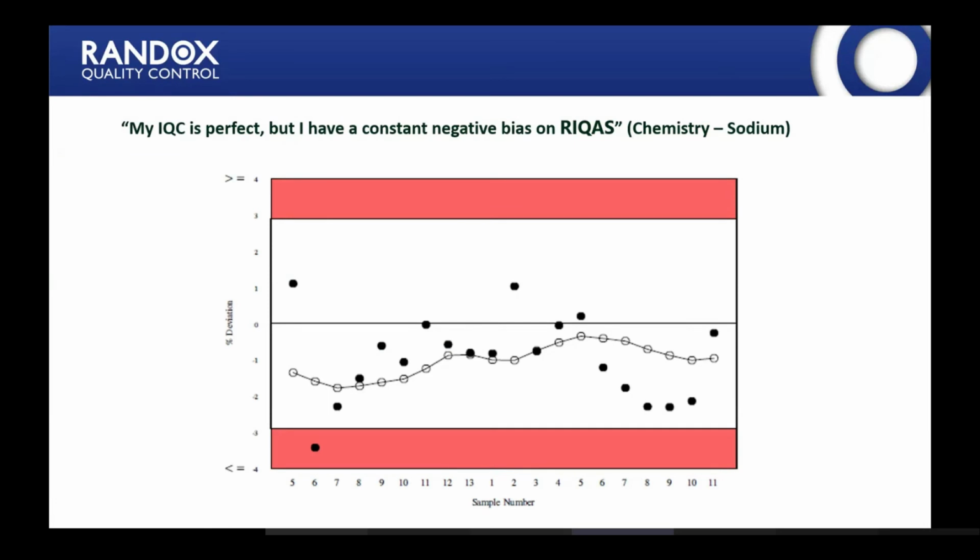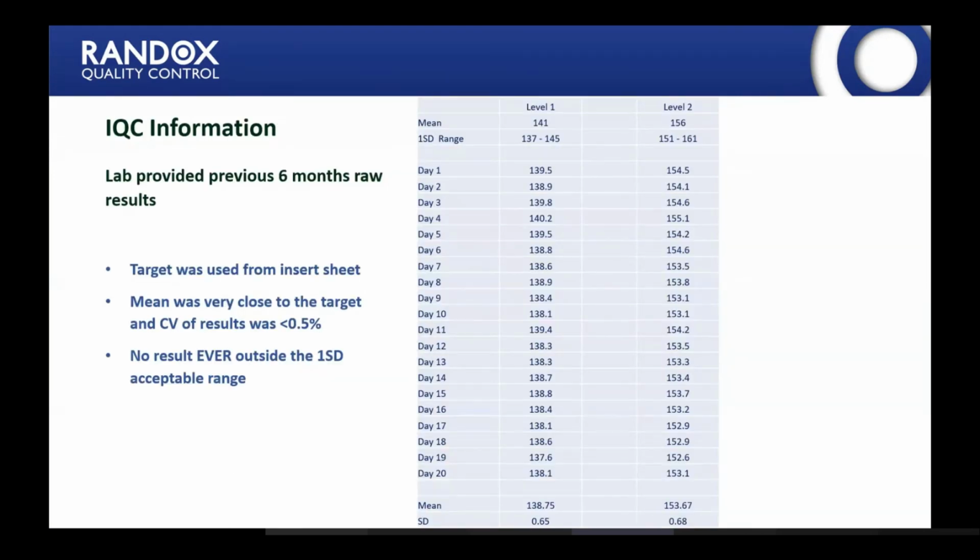Okay, this is an example. I've used it before, but it's a perfect example for this sort of situation, where this lab came to us and said, my internal QC is perfect, but I have a constant negative bias on RIQAS. And certainly looking at it, they do have a negative bias on the EQA report. Whenever we asked for their internal QC, they were using a target which was used from the insert sheet, so it was a fixed target.